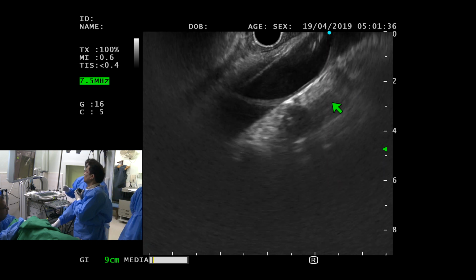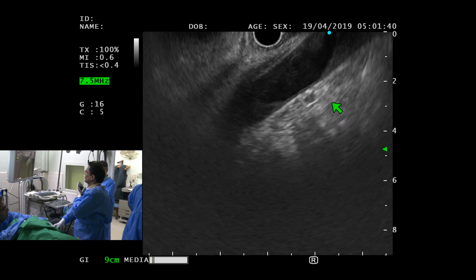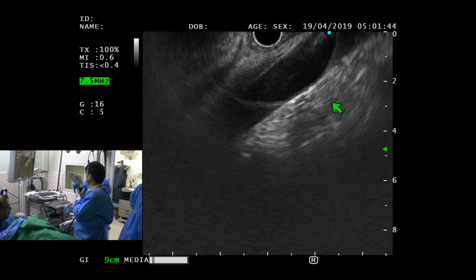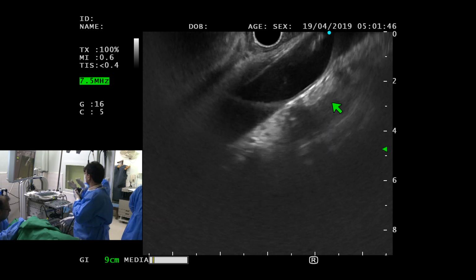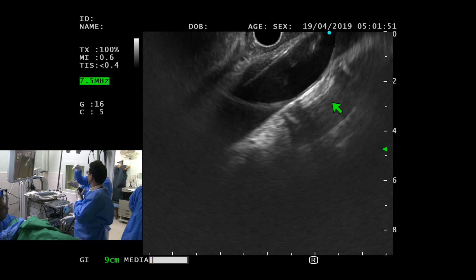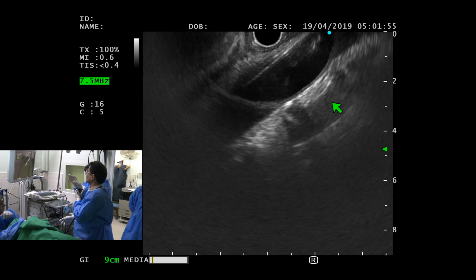This is where you get, so जो लोग ERCP करते हैं audience में, you know at this point, because हमें पता है कि जो GOJ है, the cardia, it takes slightly left turn. इस वक्त हम उसके ऊपर हैं, therefore हमें resistance feel हो रहा because we're going in the wrong direction. We know we have to go slightly left curve.